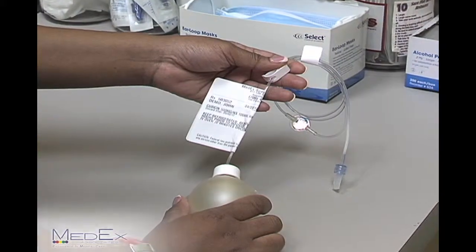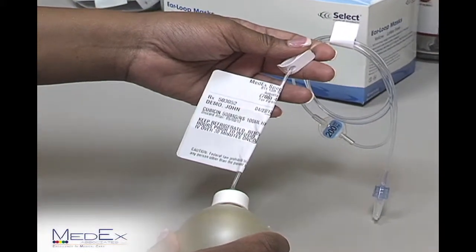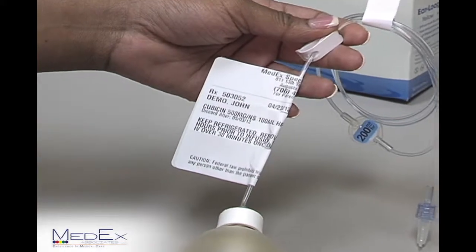Hi, my name is Montresta Johnson. I'm a registered nurse with Med-X Associates. Today, I'll be showing you how to administer your antibiotics from home. First, you want to pull out your antibiotic between six and eight hours before you're getting ready to administer the drug.